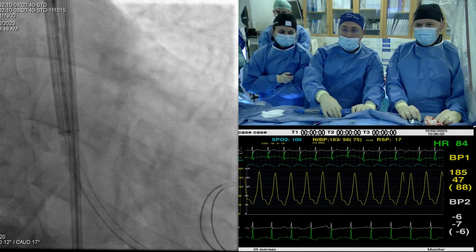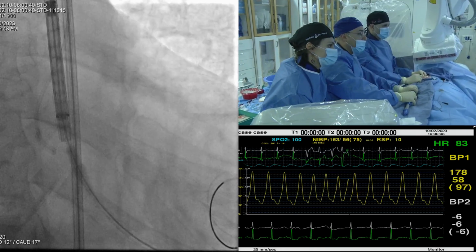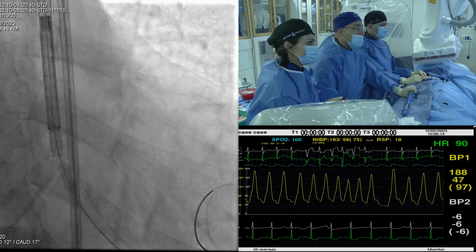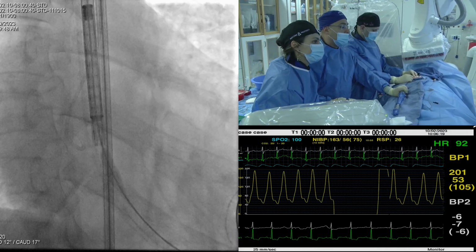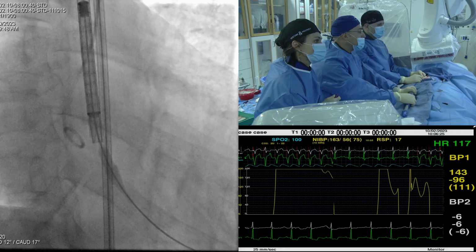Maybe we'll start the first step a bit quicker, yeah? Maybe you can pace at 120, Muhammad. Let's take a test, maybe? Yeah, let's take a test. Okay, so we are like minus one. Yes, please, guys.